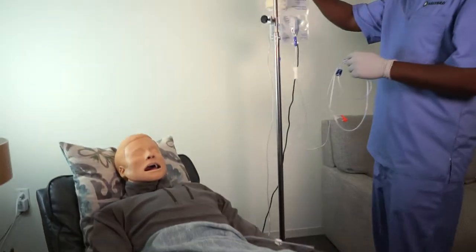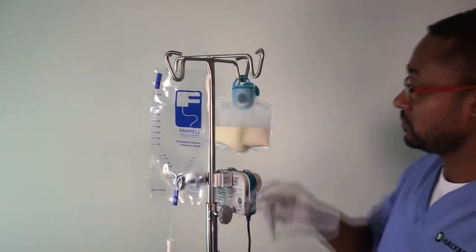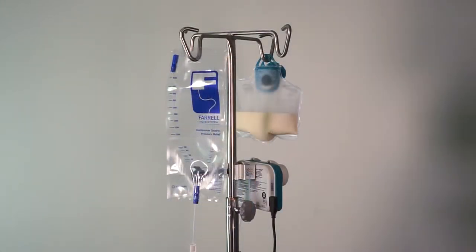To get started, hang the FARRELL bag on the same IV pole as the feeding container. The FARRELL bag should be the same height as your feeding container.